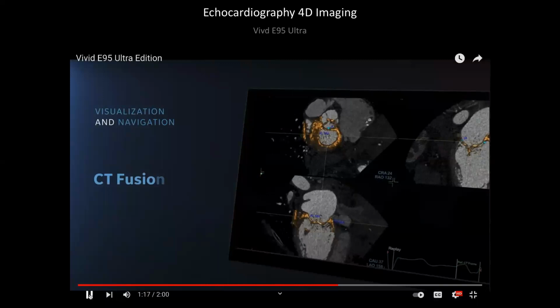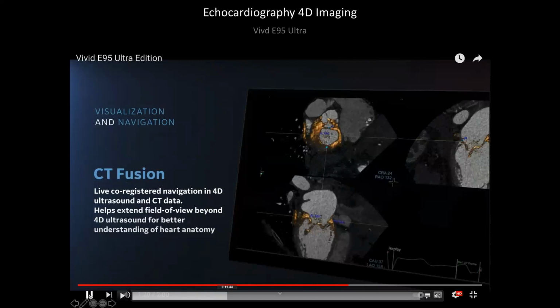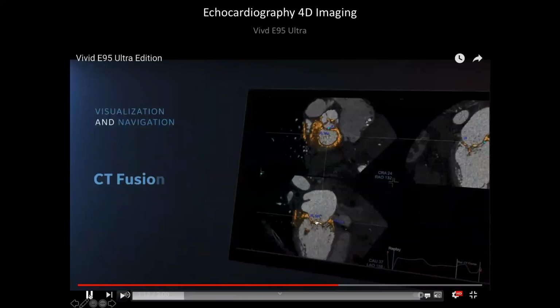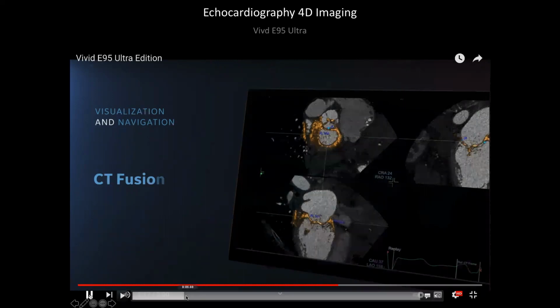And so just the way we looked at PET on top of CT and SPECT on top of CT, you can now do that with echo on top of CT, which for certain applications could be useful, but right now I can't tell you which one is the most useful. I think planning, if you were planning an implant, and you wanted to know precisely the dimensions of everything, and then in real time you had your echo on top of it, so you could see where things were with respect to the CT, would be advantageous, right?